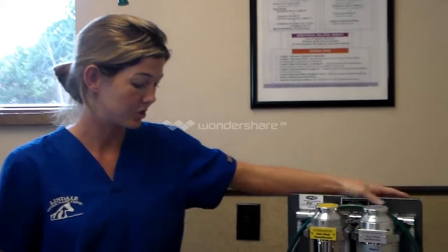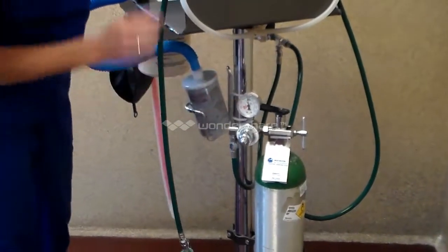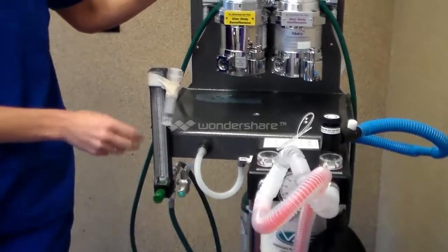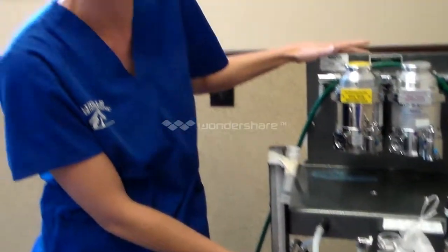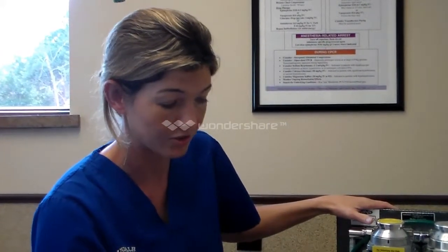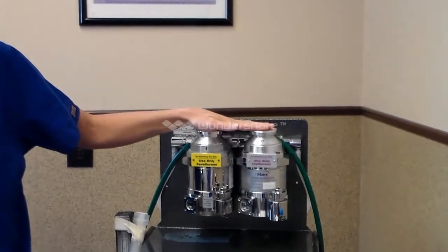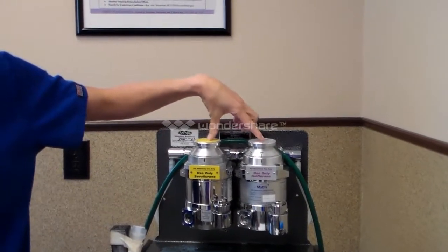Okay, this is our anesthesia machine. We're going to start off with our oxygen supply. Our intake on the back here, it is turned on and it is full by this gauge here. Comes through a pressure reducing valve up to our oxygen flow meter. This controls the amount of oxygen and the rate that our oxygen and anesthetic gas mixture is delivered to our patient. Our oxygen fast flush valve is here. This is used if we are trying to rid the system of waste anesthetic gases, if we're going to allow our patient to breathe oxygen for a little while afterwards, we can use that to flush, obviously providing that these are off, to flush the anesthetic gas out of the system. We have our vaporizers up here. This particular machine has both sevoflurane and isoflurane. They are in line. It's very important to only have one of these on at a time.